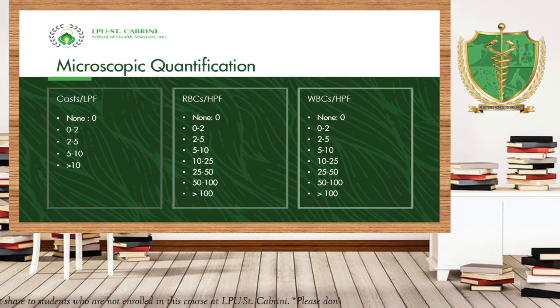We are not using TNTF anymore. Before, we were using TNTC, rather. I'm sorry, TNTC, too numerous to count or too many to count. Some say too many, TMTC or TNTC. We are not using too numerous or too many to count anymore, but instead we are using the word numerous. So, ibig sabihin madami. But you still have to follow the procedure or the protocol of the laboratory where you are going to work.